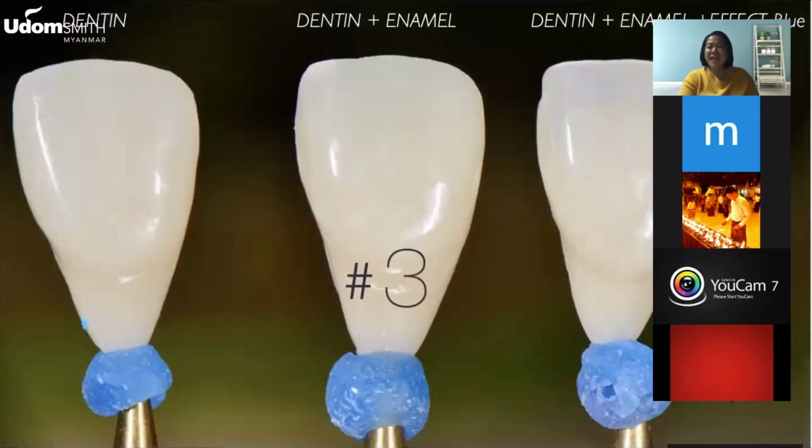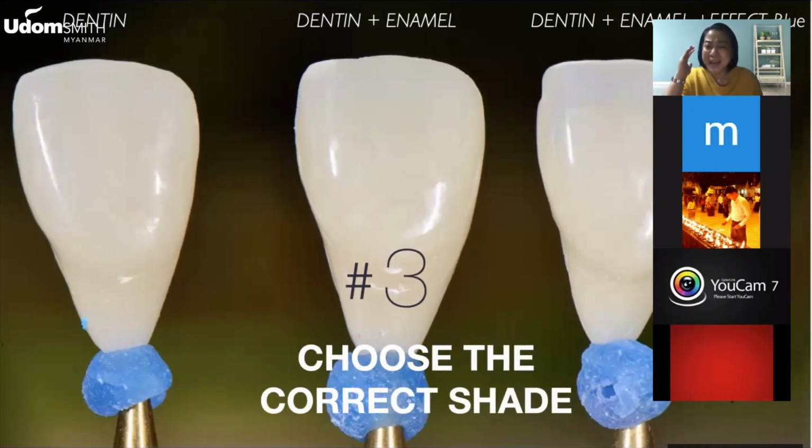The third reminder is you get the correct shade. Now, this is my tip to you. If the patient is happy with the shade of their teeth, like me, when they did the Edelweiss on my teeth, I am happy with the shade of my teeth. I don't like to make it look artificial. I don't like it white. So, if your patient is happy with the color or shade of her teeth or his teeth, then just use the enamel shade of Edelweiss. That's it. Edelweiss, enamel shade, and then it will reflect the natural color of the tooth. You do not have to make it complicated.